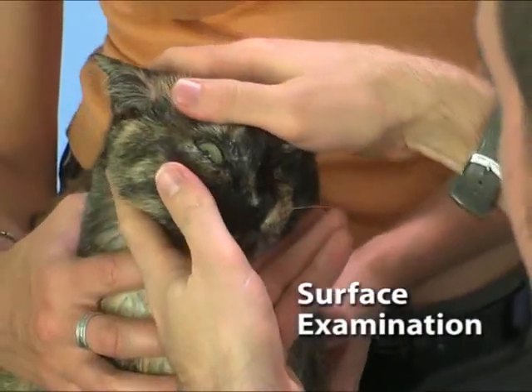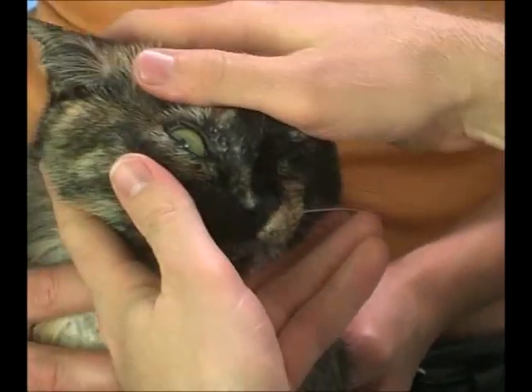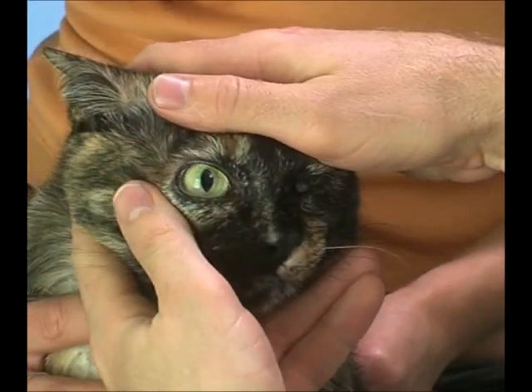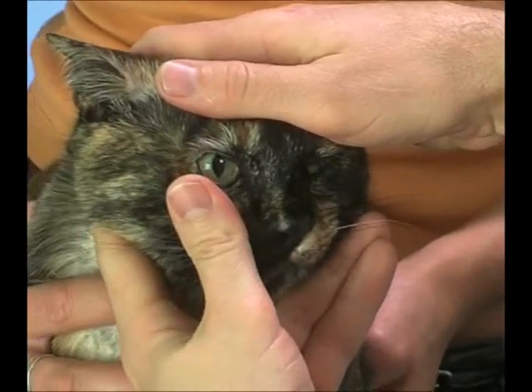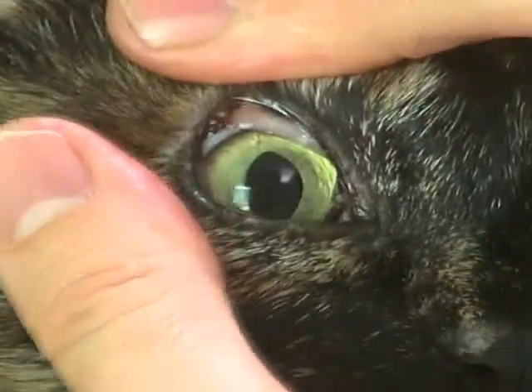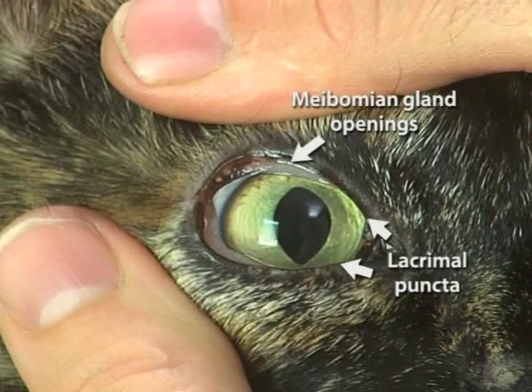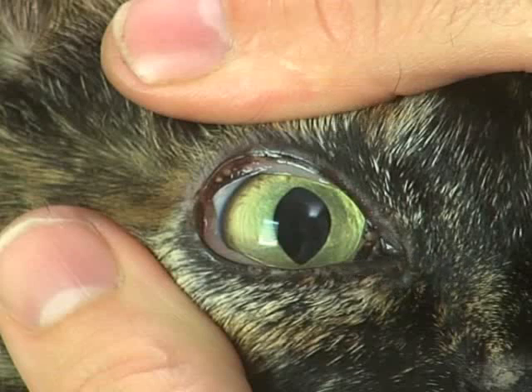The surface of the eye should now be examined in detail, beginning with the upper and lower eyelids. The eyelids should then be everted to expose the eyelid margin. This reveals the openings of the meibomian glands and the lacrimal puncta. In this case, inspissated meibomian glands are visible under the upper eyelid.